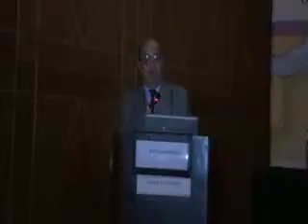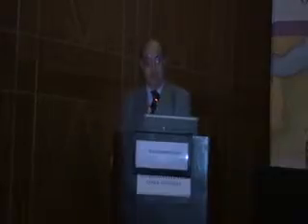There is no isocenter, but there are so many thousands of isocenters for this CyberKnife. This is Clarity again, that it can be done.